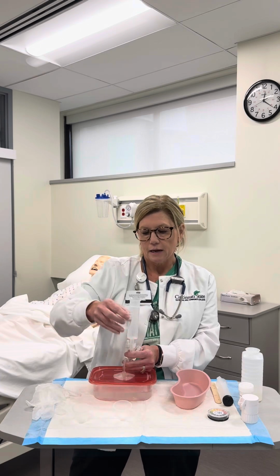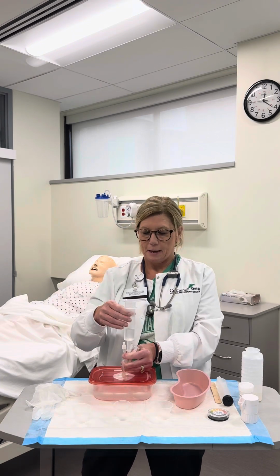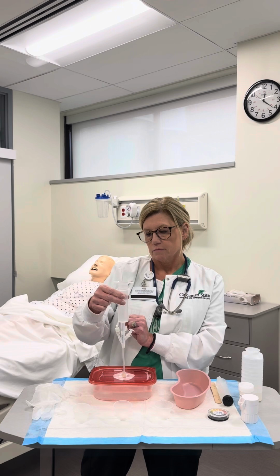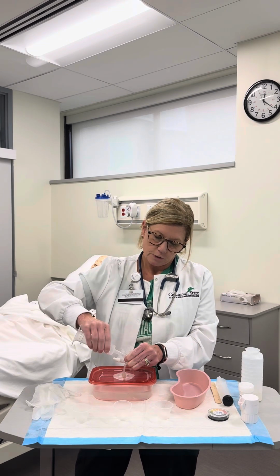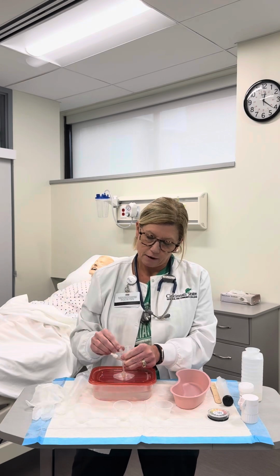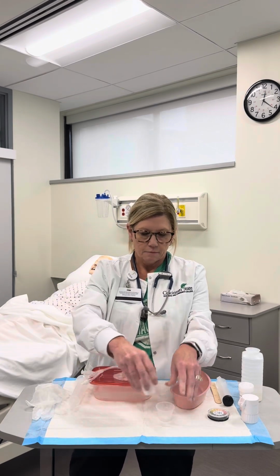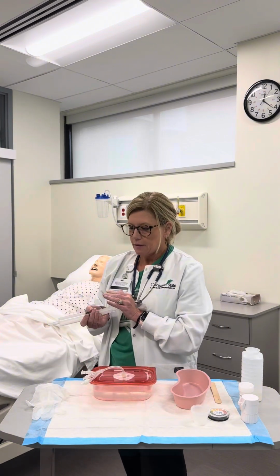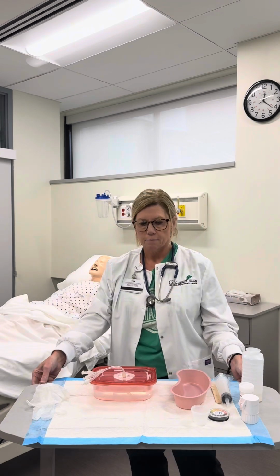And then lastly is my last flush. Okay. Let that go in. Okay, and then we're finished with that. I want to take that off, put the cap back on, just clean up my area, okay? And then next thing I want to do is do my patient teaching.